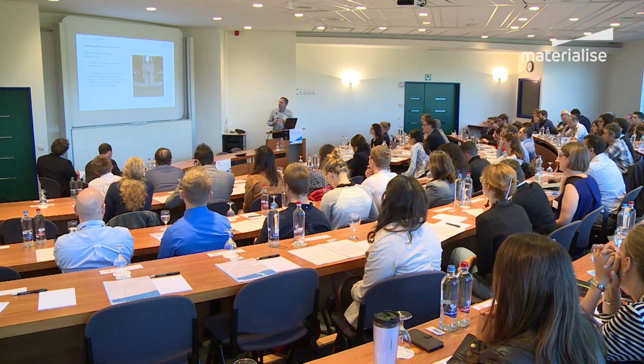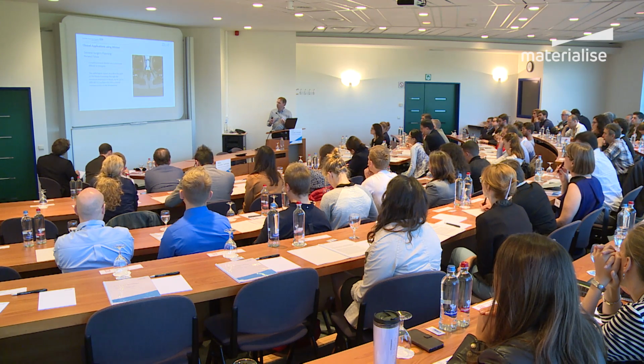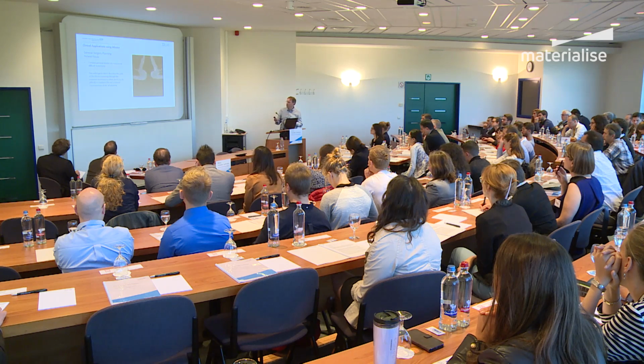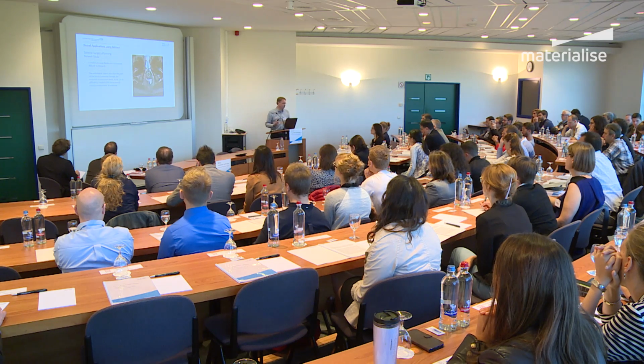Into general surgery for planning of perianal fistula. This is an MR data set of a fistula, and it's notoriously difficult to interpret. It's difficult for the radiologists and almost impossible for the surgeons to work out what's going on in these images.